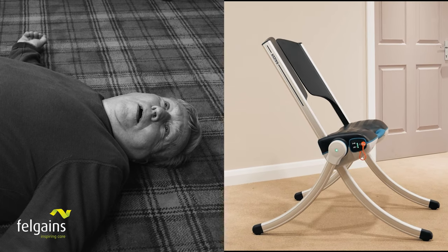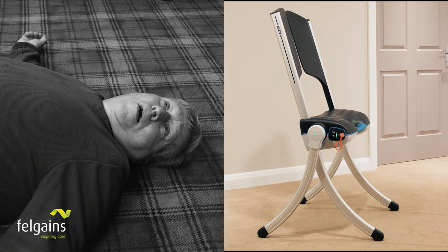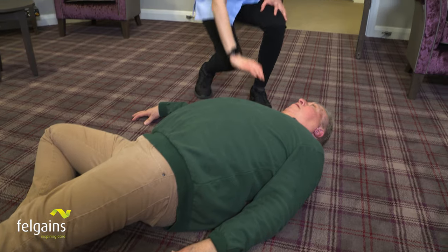Do you have an issue with falls in your care environment? When dealing with falls in any situation, a quick response is essential. A fifth of residents admitted to hospital after a non-injury fall will have been on the floor for more than half an hour. And of those, half will die within six months from related complications.